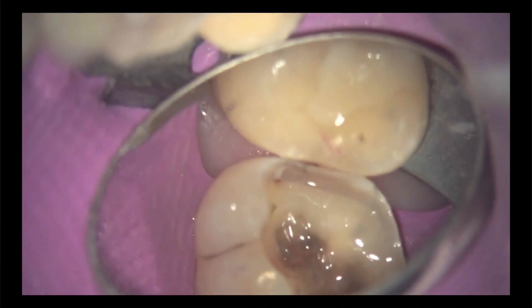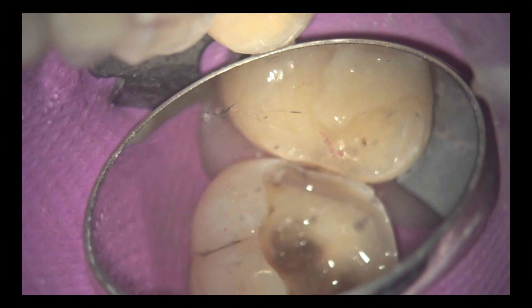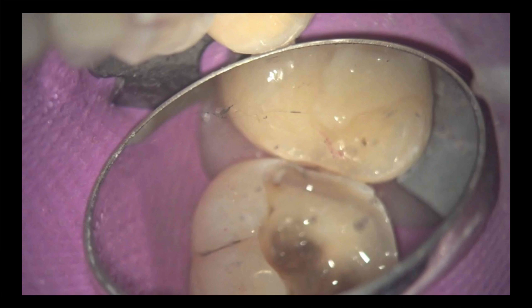So at this point, I've prepped the tooth by taking out the old restoration. There was a large old amalgam here. And the patient had a food trap on the distal and there was caries on the mesial, but it hadn't been prepared yet. I'm actually going to do an onlay for this tooth, a porcelain onlay, probably a monolithic Emacs onlay would be my restoration of choice, but I need to refine the preparation. And so there's some caries on the mesial. There's some caries on the distal. I'm going to clean that up. The distal wall doesn't have a shell because there was an amalgam there. The mesial wall has the shell that I described to you. So you'll be able to see that technique. And you can imagine it being done with just a little slot preparation as well. So let's watch this.